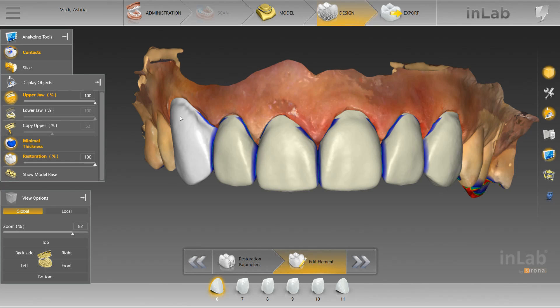As you can see right now, there are some discrepancies that the software created when copying the wax up. These are easy fixes and I want to run through how to get these fixed and get your crowns in the mill.